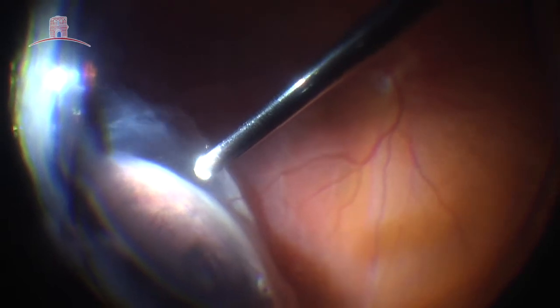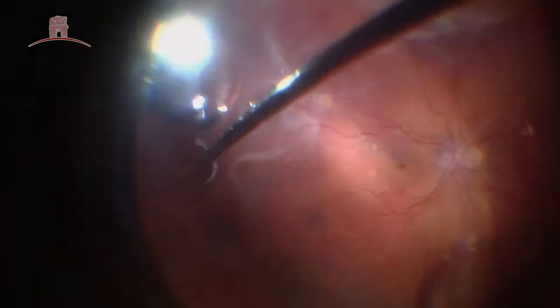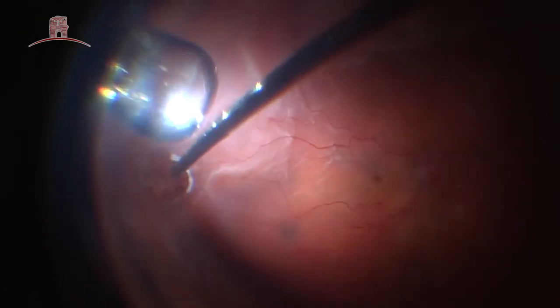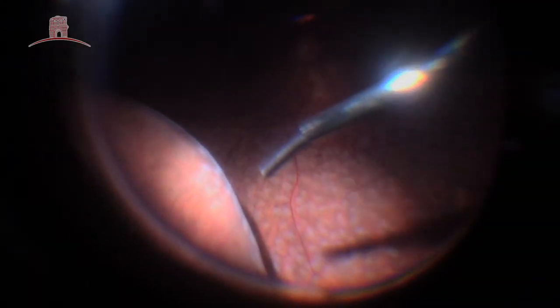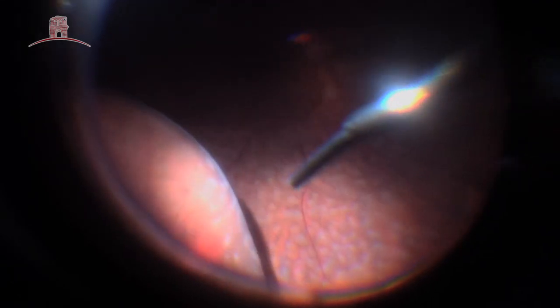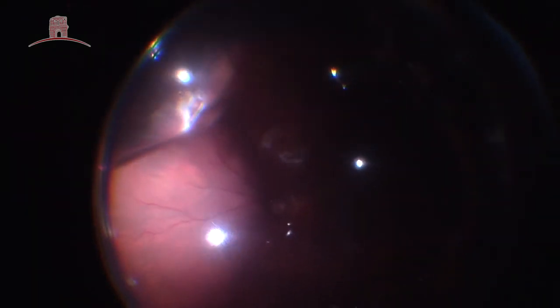Vitrectomy, PVR peeling, the marking of dehiscence by endodiathermy, fluid air exchange, peripheral photocoagulation, and retinopexy by cryotherapy or photocoagulation.